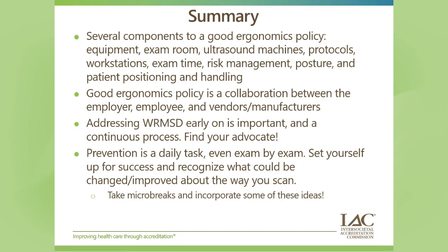So a good ergonomics policy is a collaboration between the employer, the employee, and our vendors and manufacturers. And we started with that from the beginning of the discussion. Addressing these musculoskeletal disorders early on is really important, and it is a continuous process.